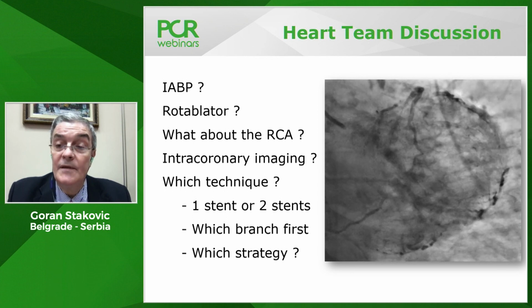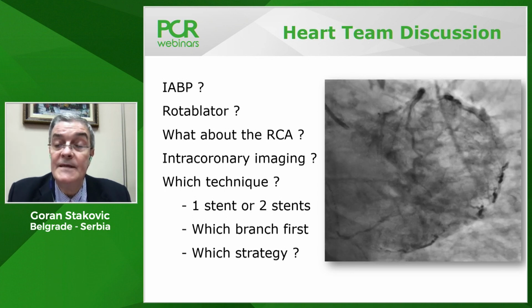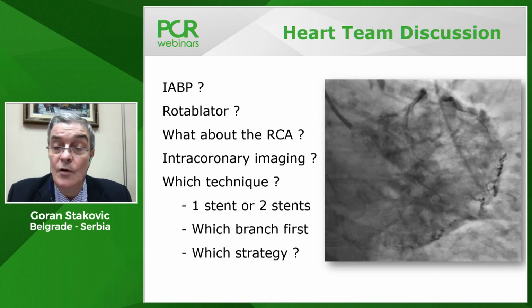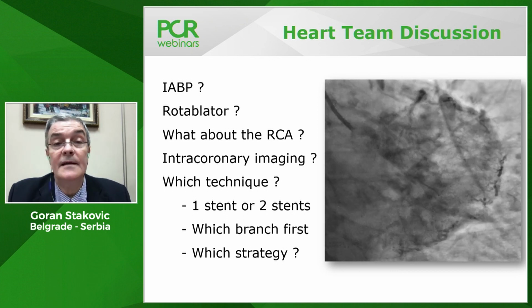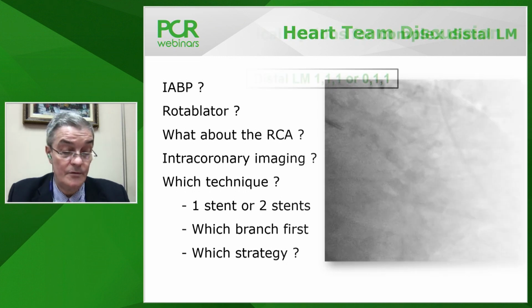So probably protecting LAD first and then culotte with minimal overlap inside the left main would be more or less my strategy, based on anatomical complexity and my personal preference regarding 2-stent technique. Thierry, what you decided yourself, this is what counts most.